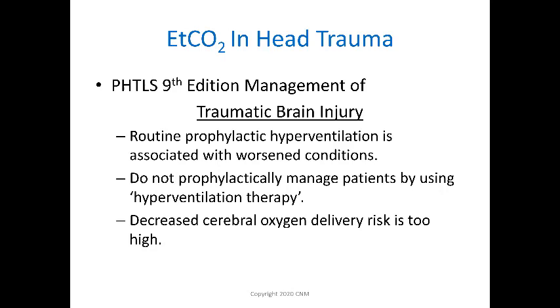There's lots of reasons for this, and the PHTLS book outlines a lot of them. But primarily, we're kind of facing the idea that sometimes when patients are in very shocky states, if you will, their end-tidal CO2 is not super reliable in patients that have multi-systems trauma or other problems with Fick principles. And so it's very easy to overdo it with hyperventilation therapy and cause the blood vessels in the brain to clamp down, making traumatic brain injury worse because of decreased cerebral perfusion, and because of that, cerebral oxygen delivery to healthy cells is deterred. Now, in that process, if the healthy cells are without oxygen, unfortunately, they'll start to swell, contributing to the increasing intracranial pressure. So we can definitely make these patients worse if we're not very careful about what we do.